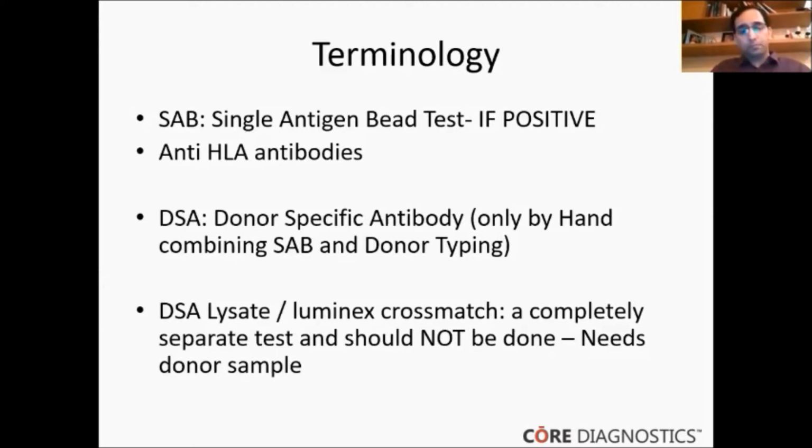And then there is this confusion that gets created by a test called the DSA lysate. It is also called the Luminex crossmatch. It is a completely separate test in which the donor cells are lysed, combined with the plate, and then you test with antibodies. And this is a test that I'm not going to be talking about in the talk today, but we can talk in the question answer session if someone wants. But it's a test that I do not recommend for anyone to do.